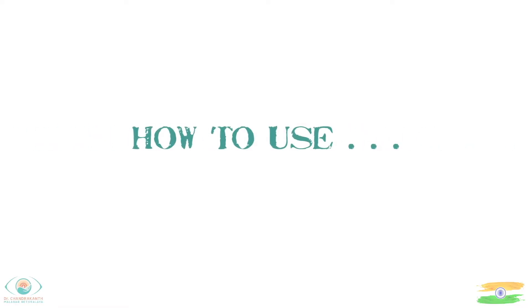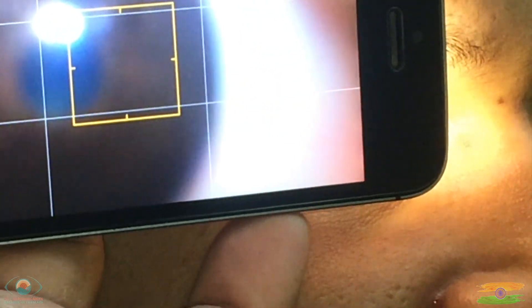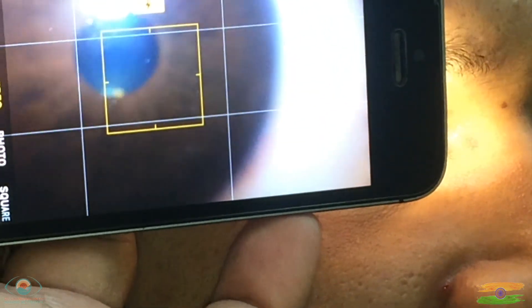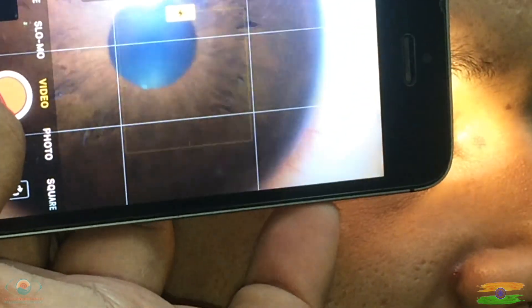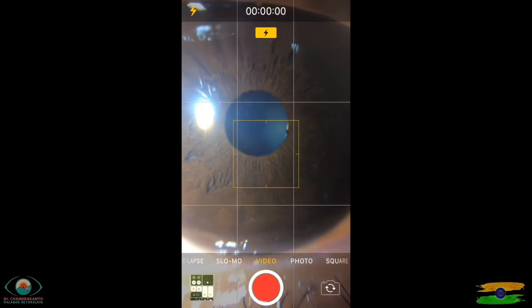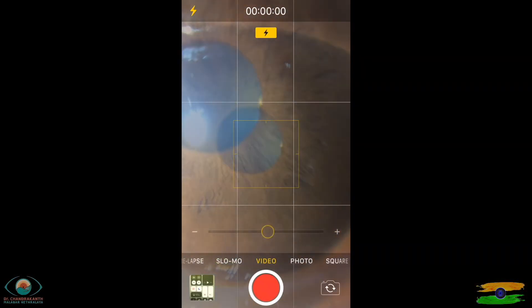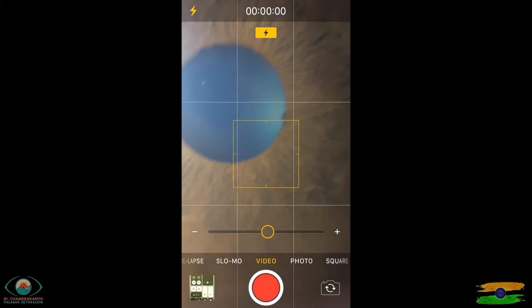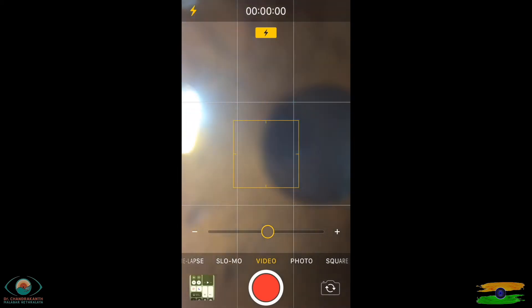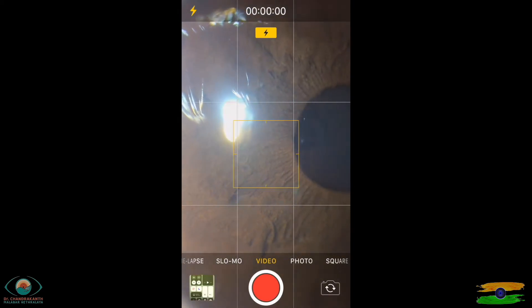The procedure should be explained to the patient and consent obtained. The smartphone is kept on video mode with the flash on. Take it near the eye, zoom appropriately, and take a video.